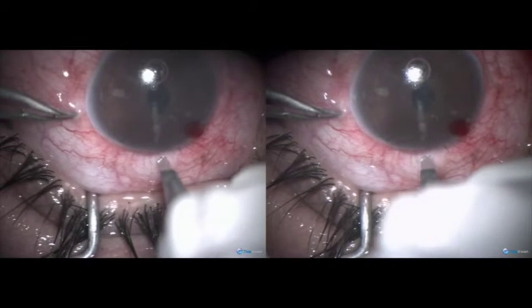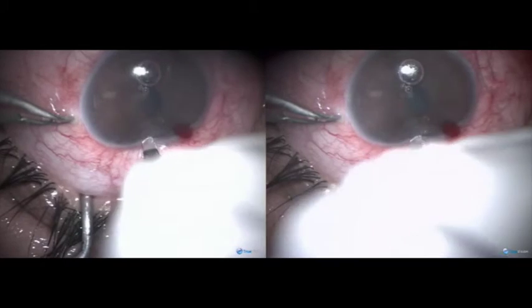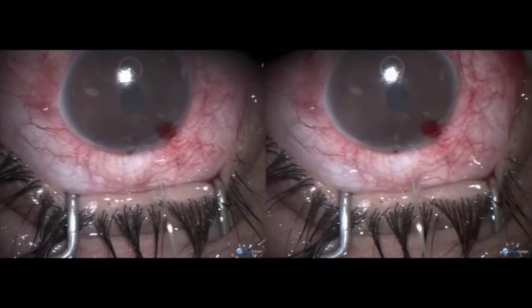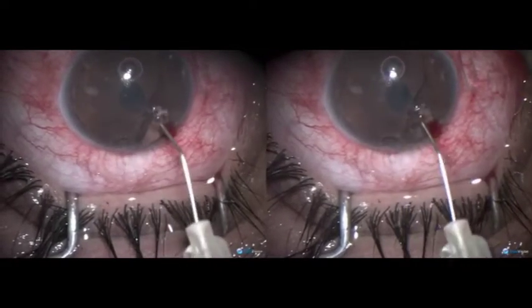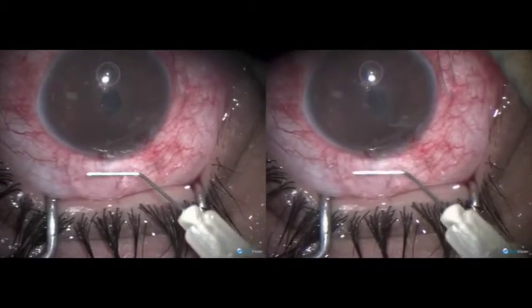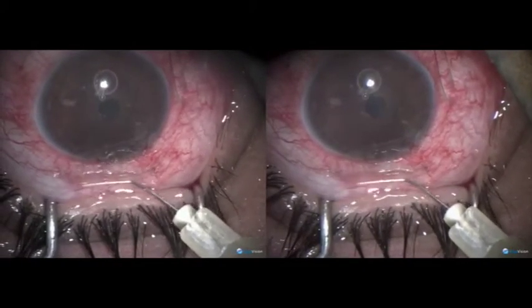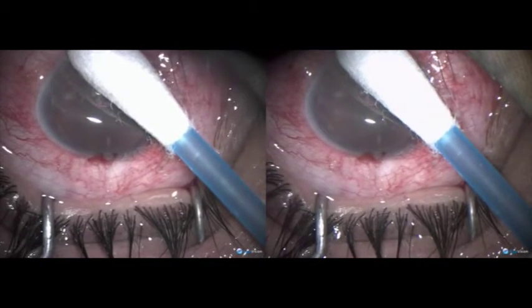For that we need a one millimeter knife — only one millimeter — just in front of the internal openings. Now the anterior chamber is deep and is filled with helon. The incision in the cornea is only one millimeter, so it's not easy to reach the iris.